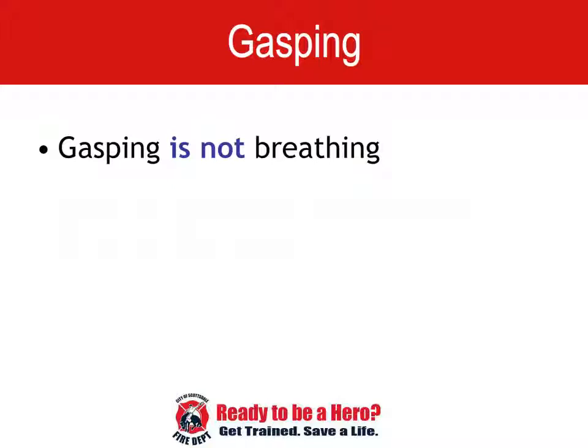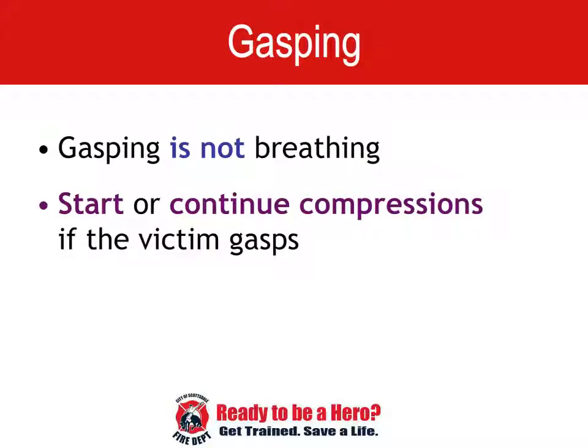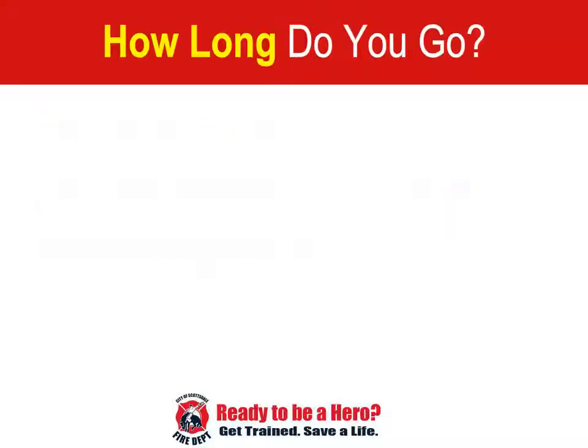If you have done a sternal rub and the person gives you no other sign of life other than gasping, start compressions. Compressions hurt. If they don't need compressions, the person will let you know. If they aren't responding to the sternal rub and still not responding after you start compressions, there isn't blood going to the brain. Keep going through the gasping. Keep going until emergency responders arrive or until the person begins to show signs of life.